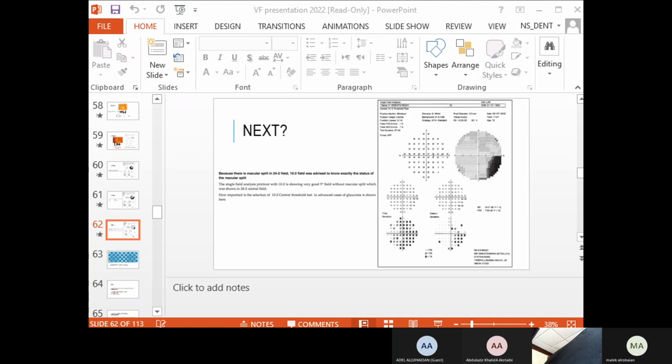But he did not have it here. Why? They corrected him. Why does it happen here but not here? They use the same lens. What happened? Same prescription. Position, I guess. The patient was not sitting correctly in the second exam.